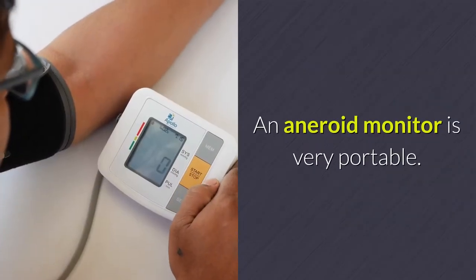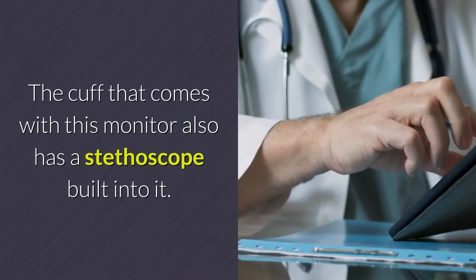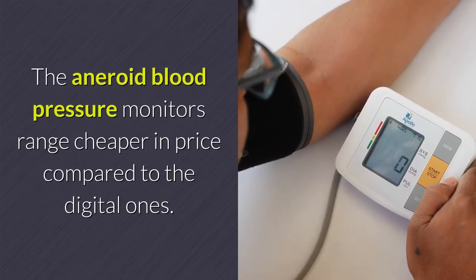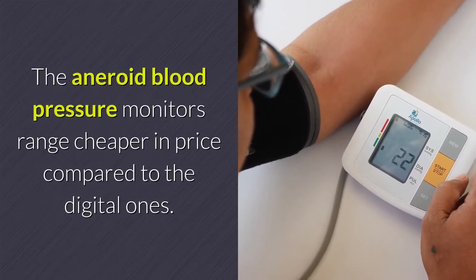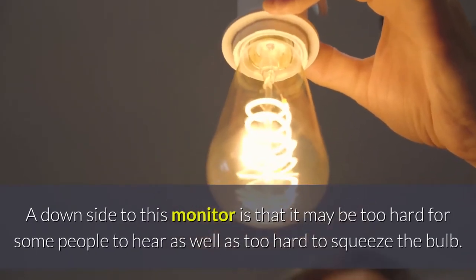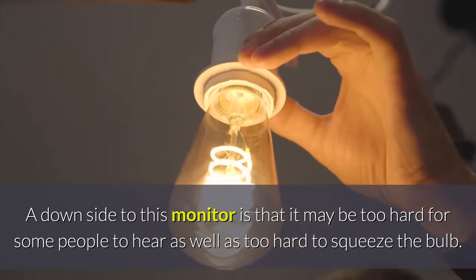An aneroid monitor is very portable. The cuff that comes with this monitor also has a stethoscope built into it. Aneroid blood pressure monitors range cheaper in price compared to the digital ones. A downside to this monitor is that it may be too hard for some people to hear, as well as too hard to squeeze the bulb.